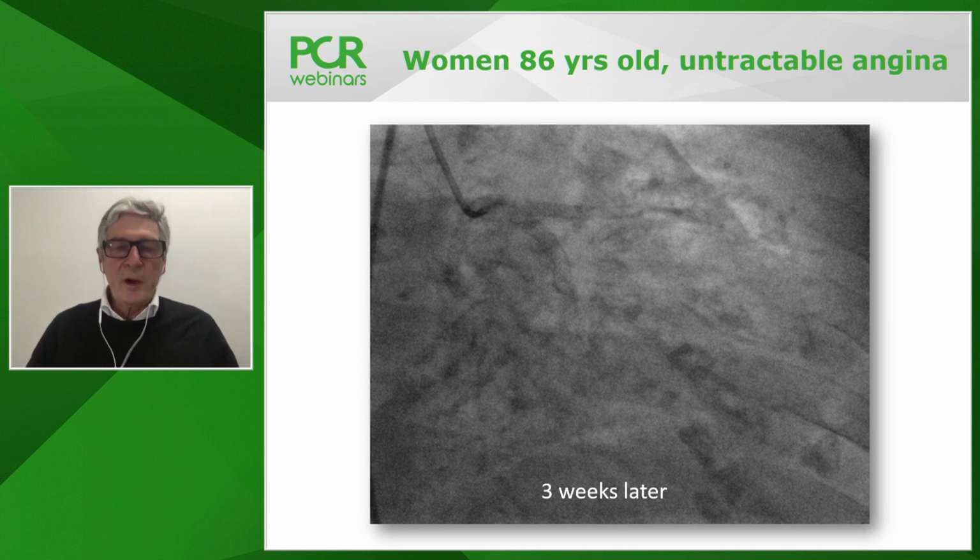Yeah, I think it's a good point, Goran. And of course, shockwave was on standby. Of course, we will not be able to go with the shockwave as a first balloon, but in case of malexpansion of the stent, I planned to use it. I think it's a very good tool to treat this kind of lesion. It's relatively safe.